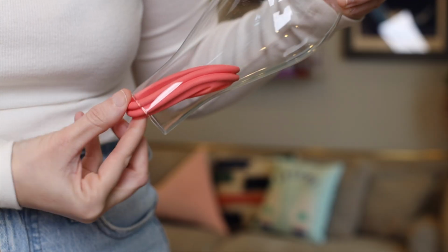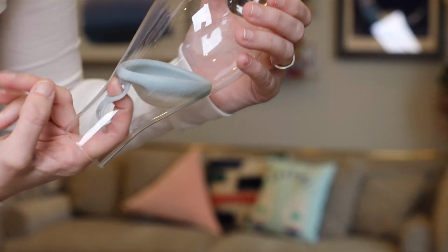Menstrual discs are also suction free. So when you remove them, and we'll get to the con on that, but the pro is that all you need to do, depending on the design, is pull the rim and pull it out. There's no suction to break. If you're using something with a removal aid like Hello Disc, you just grab one of the loops and pull it out. You don't have to navigate through breaking the suction. It's just going to pull out, no drama. And this also is better if you have an IUD.